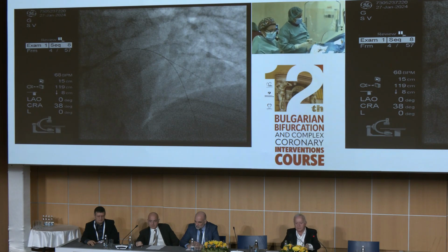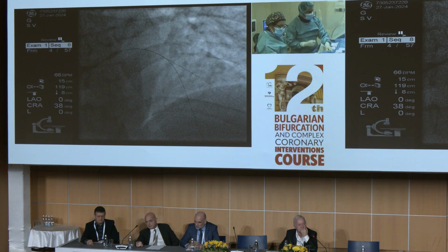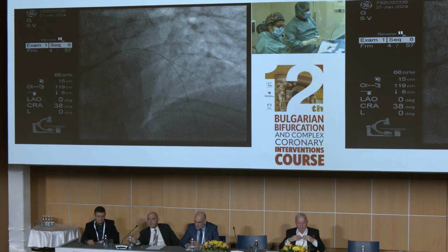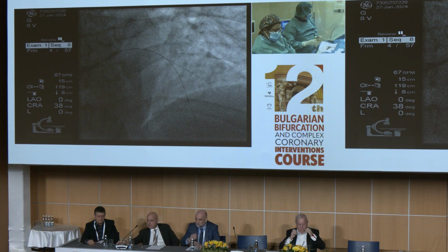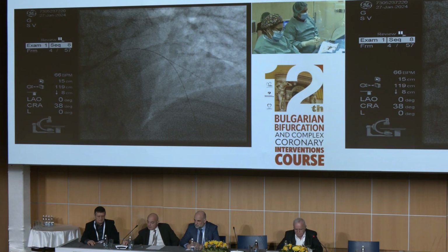But during that time, we're preparing the assist IVUS. This session will be recorded in English. Open the door. Close the window. So, we are waiting for the IVUS connection.